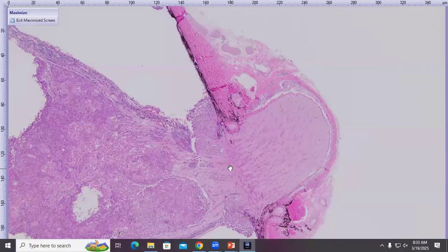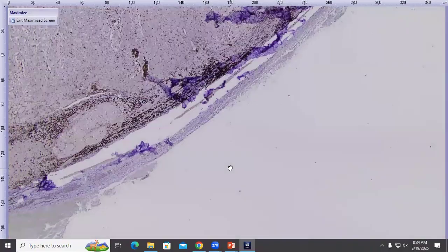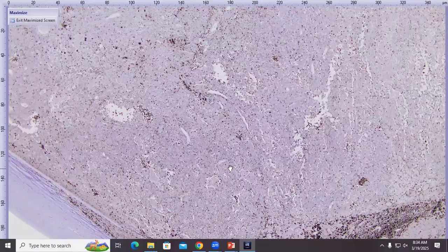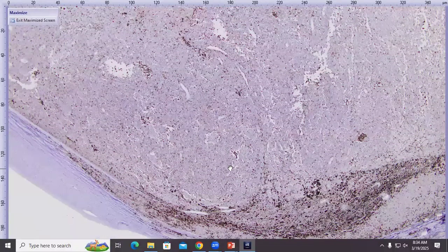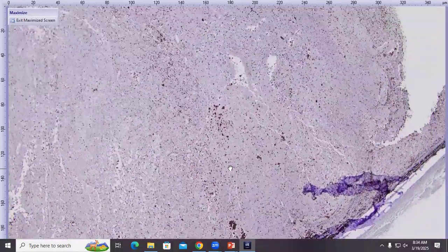So we did offer CD204 for histiocytes and Melan-A for melanoma to help narrow down what type of tumor this was, because they have different prognoses for the patient. Histiocytic sarcoma, usually when we get it, is a very poor prognosis for the patient, usually about a 3-month survival time, whereas a malignant melanoma is not as bad for the prognosis. So this is a CD204. So this is marking our macrophages.